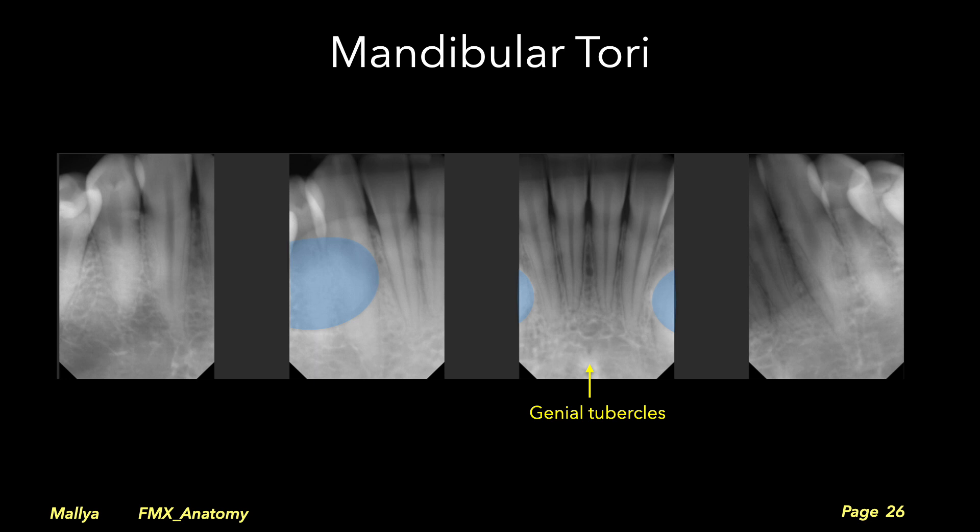Note the genial tubercles that appear as a diffuse radiopacity in the midline. You may also see the opening of the lingual foramen adjacent to the genial tubercles.